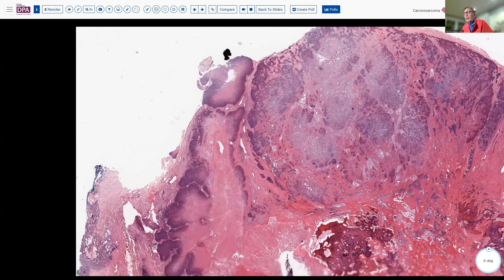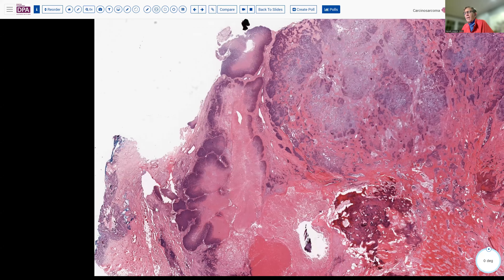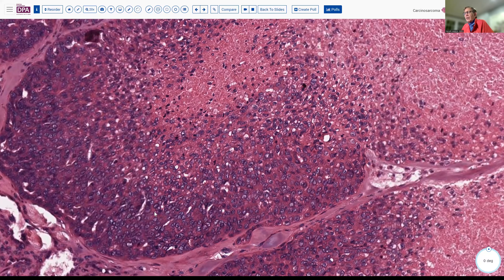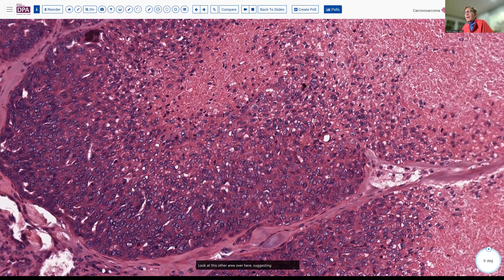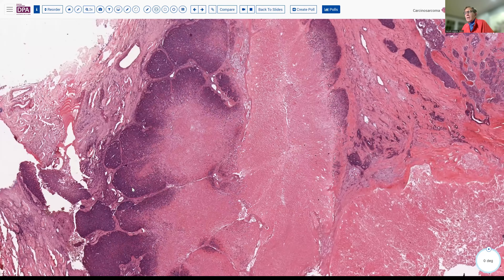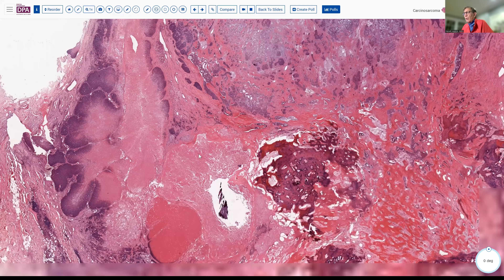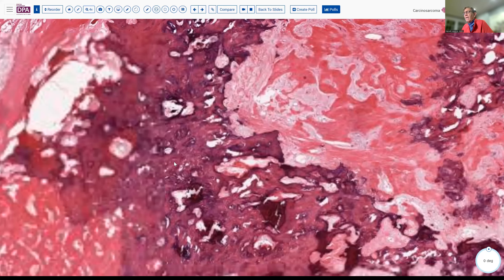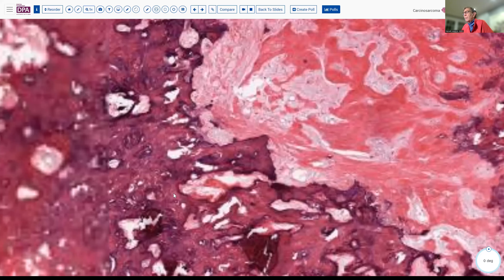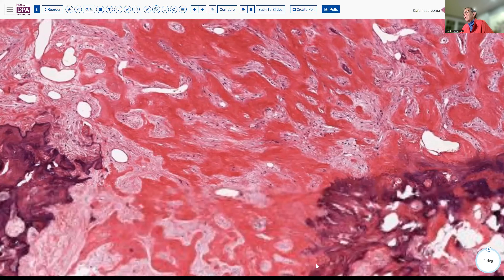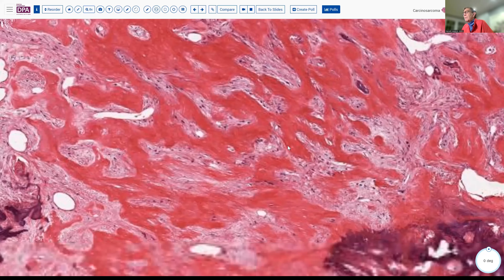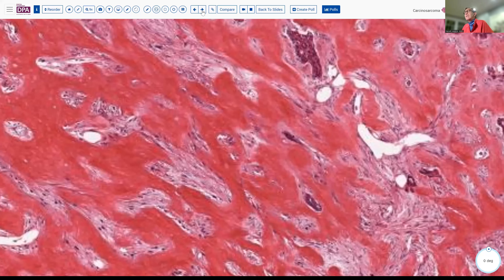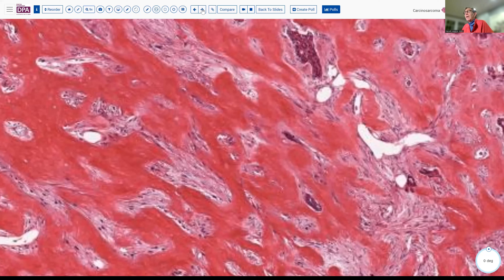It's always good to remember that you can analogize with the breast in many circumstances in this situation. Looking at another area, there's a kind of small cell or undifferentiated carcinoma type of component here. I'm not sure I would have called this carcinosarcoma because I haven't seen what I would consider a sarcomatoid stromal component — we have the bone formation but it's not clearly showing truly high-grade malignant spindle cells. So it may be metaplastic or reactive bone in that setting.